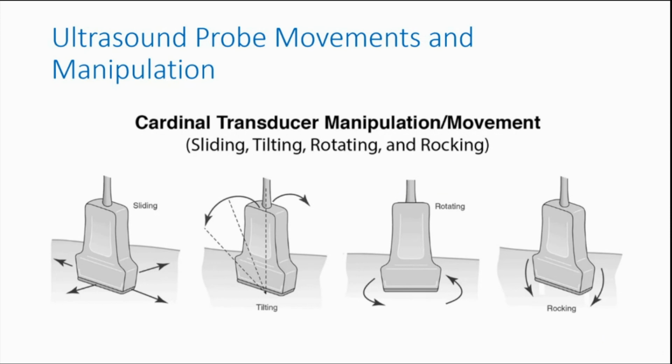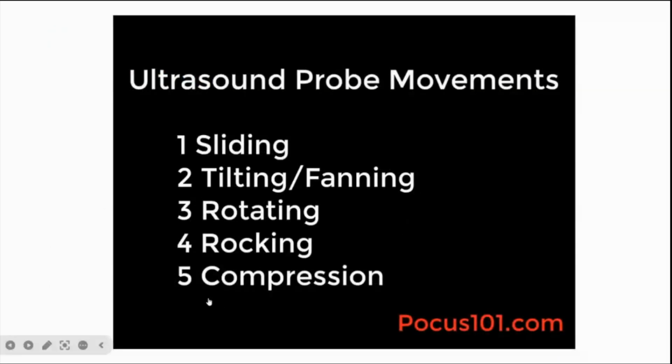So some of the cardinal movements will include sliding, tilting or fanning, rotating, as well as rocking. So let's spare a few seconds to watch a short video on these cardinal movements.